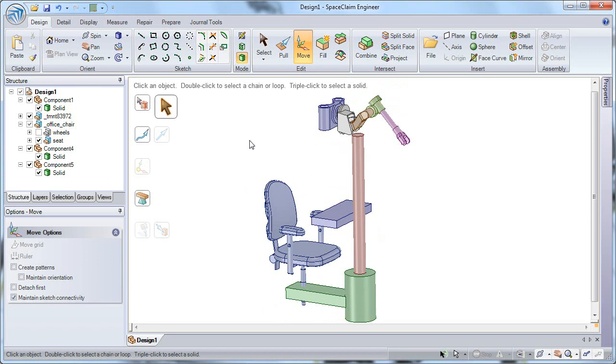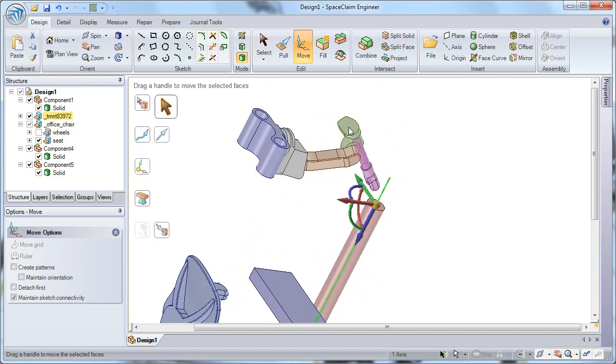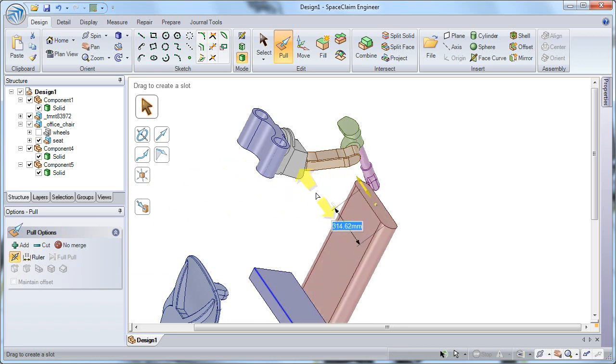So what I'd like to do, you'll notice that the arm has two separate cylinders. So let's edit our cylindrical mount so that it can take the correct mating for that arm. So we're going to pull on the center axis, which creates a slot, but it's going in the wrong direction. So let's escape out of that, change our pull direction from our tool guides, and specify a pull direction along the front of that table. Now you can see that I'm able to create a slot in the correct direction, and if I toggle on pull both sides for my pull options on the left, I can now create that slot symmetrically in both directions.